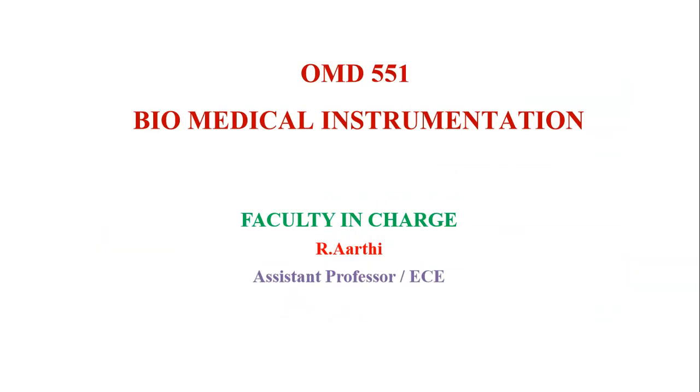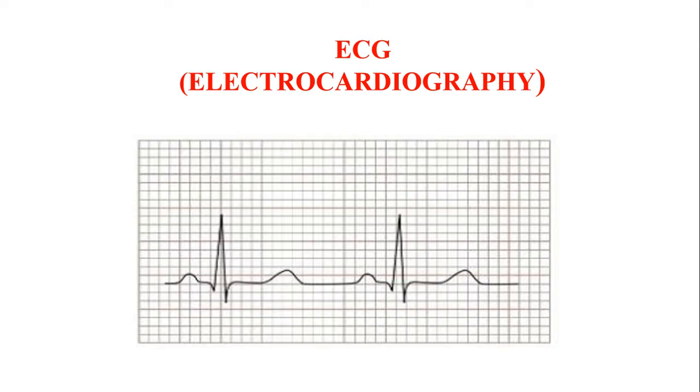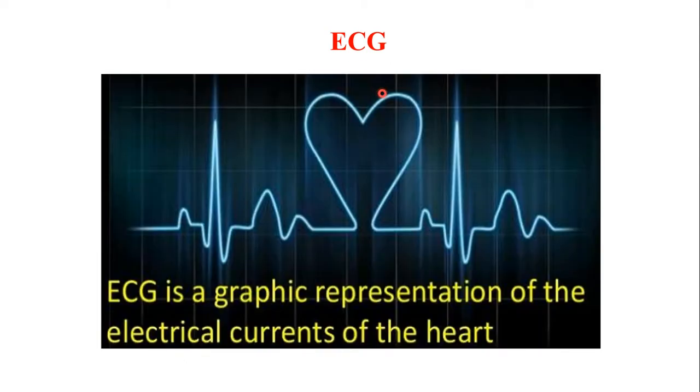Hello everyone. In this video we are going to discuss biomedical instrumentation, specifically the ECG signal. ECG stands for electrocardiography. As the name indicates, cardio, it is going to measure the electrical activity of the heart.